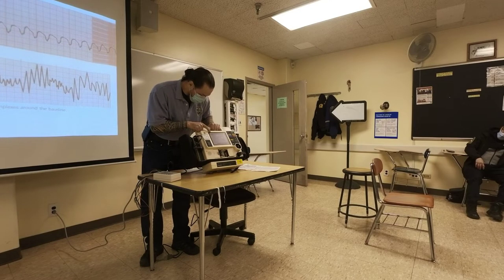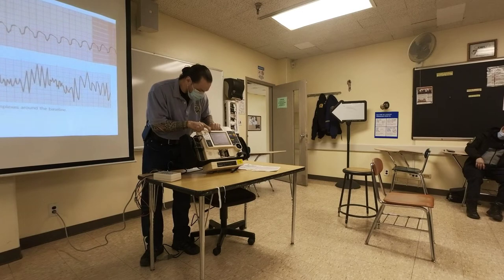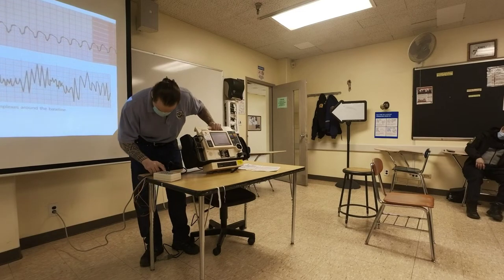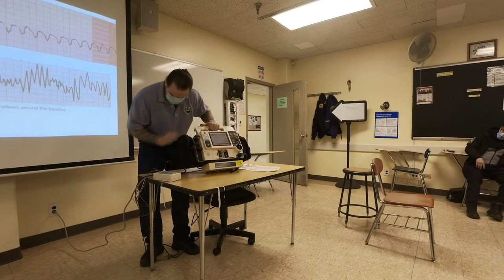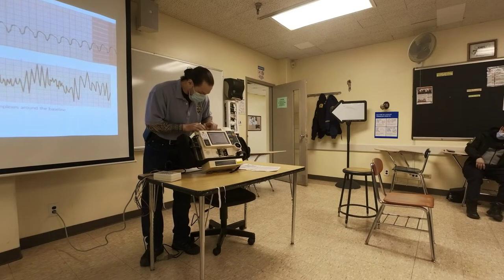Ventricular fibrillation is usually irregular, and you notice how the heart rate starts to jump around. So that is a clue that I'm probably not dealing with ventricular tachycardia. I'm going to put polymorphic form. This is a polymorphic form. This is actually torsades the way they have it here, twisting of the points. So here it will fluctuate.